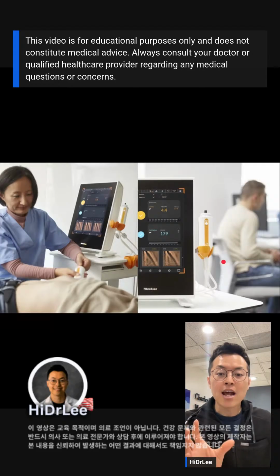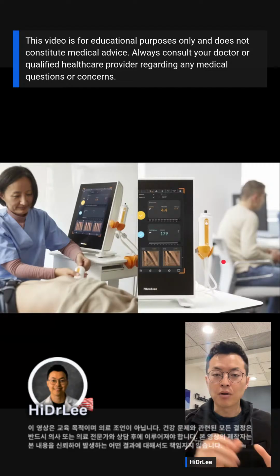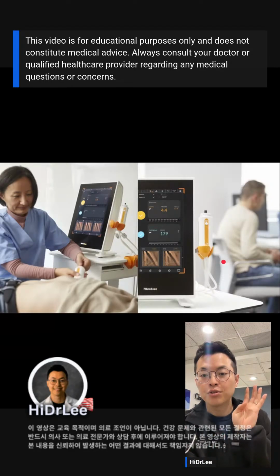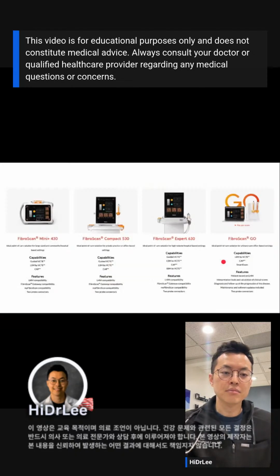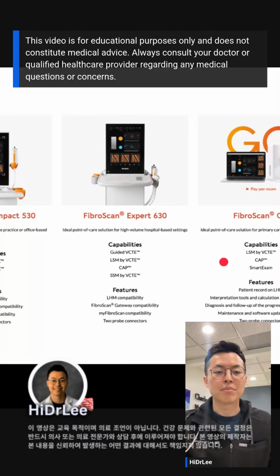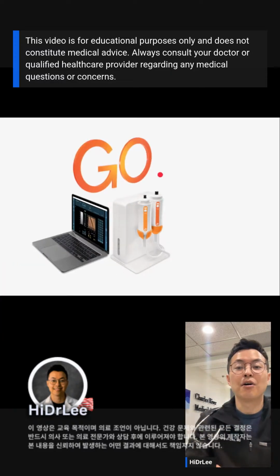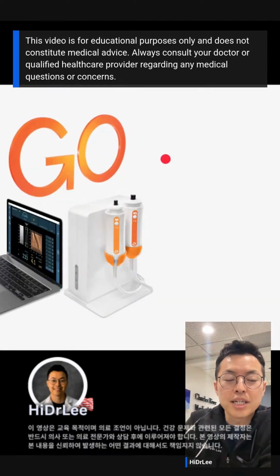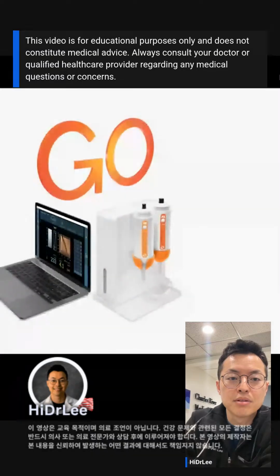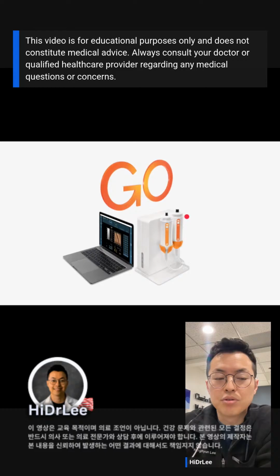Fibroscan can tell how much fibrosis and scar tissue is formed in the liver. So it tells you how much fat you have in the liver and how much scar tissue you have in the liver at the same time. There are many different types of Fibroscan, and the one we have is Fibroscan Go. By the way, there's no difference in test quality or accuracy among different models. Fibroscan Go is what we use.